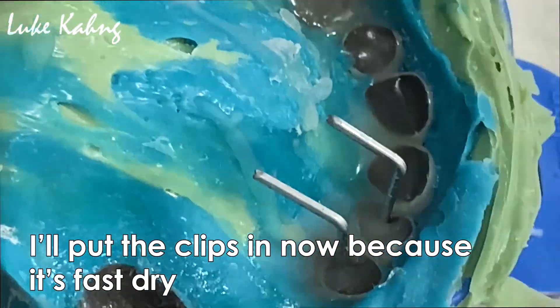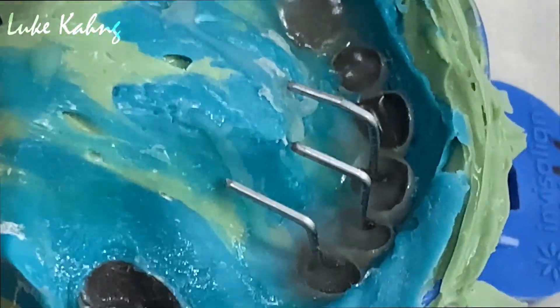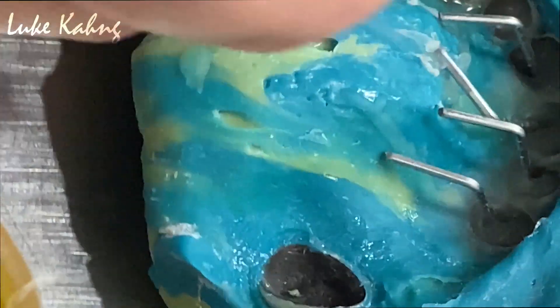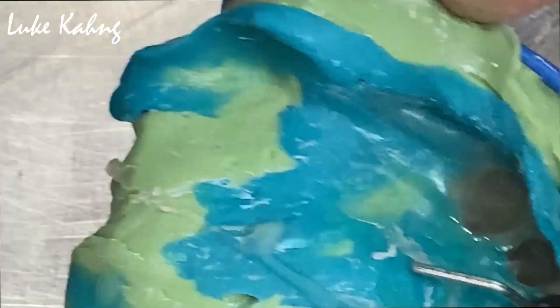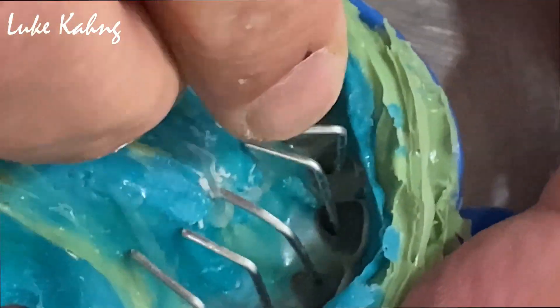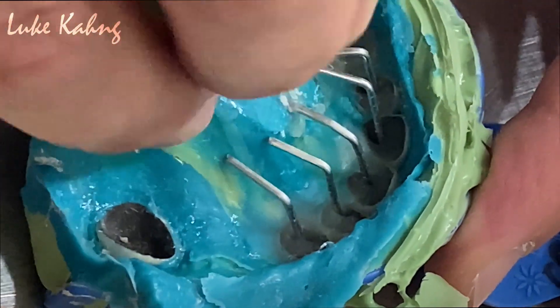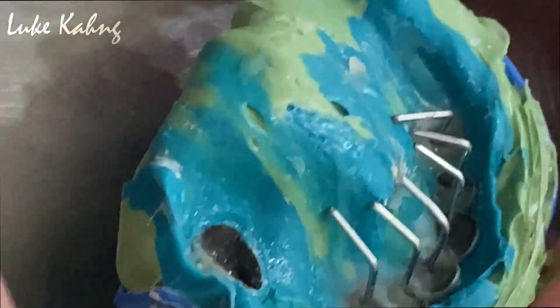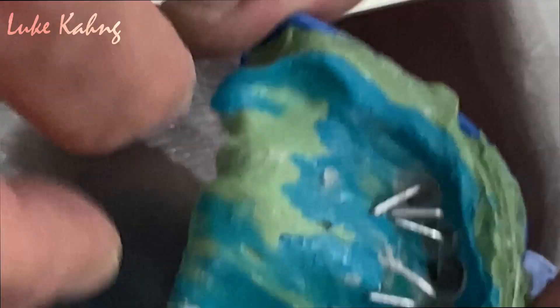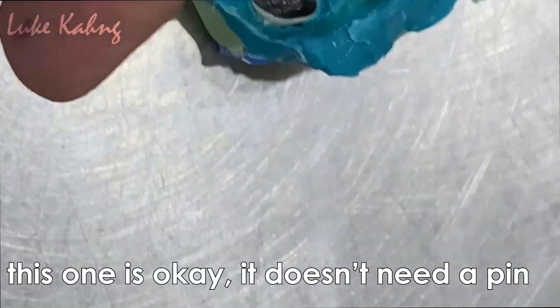Right now let's put it in the pin because it's fast dry. We're going to do this later — or we don't need this because this is huge. Nice. Alright, let it dry. That one is okay so we don't need a pin.